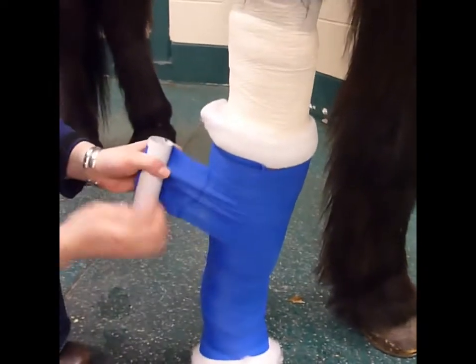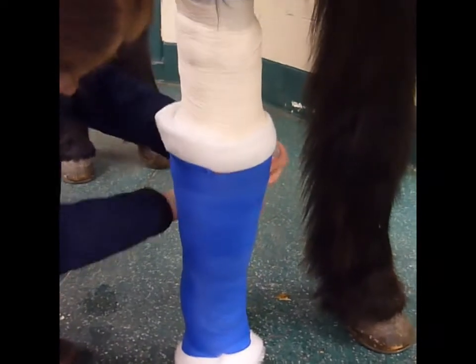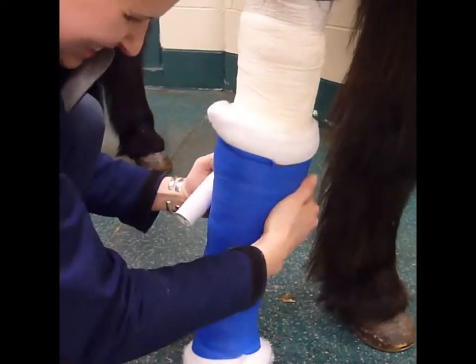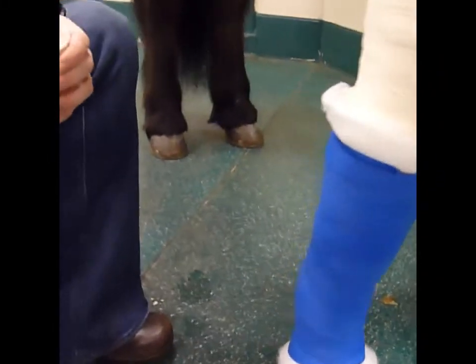Given our barn is not heated, it's usually about 10 degrees above the ambient temperature, so it's going to be around zero. But that'll be nice and warm. I'm going to stick the vet wrap to itself. And then this is Elasticon — we're just going to put it at the top and the bottom just to keep anything from slipping.